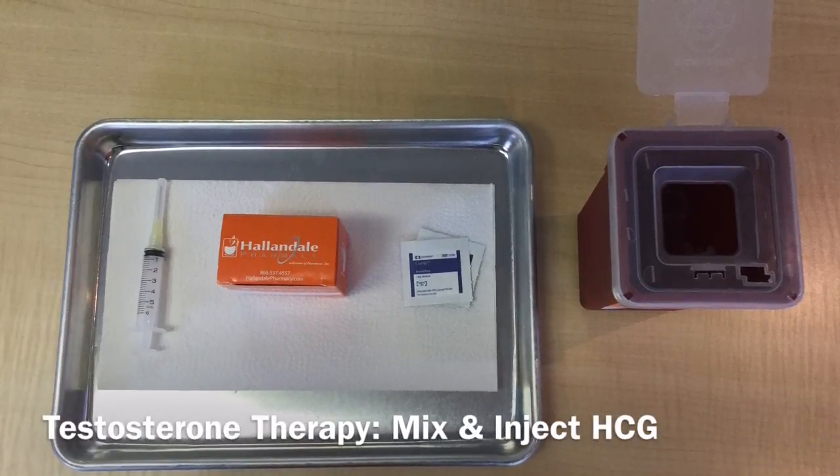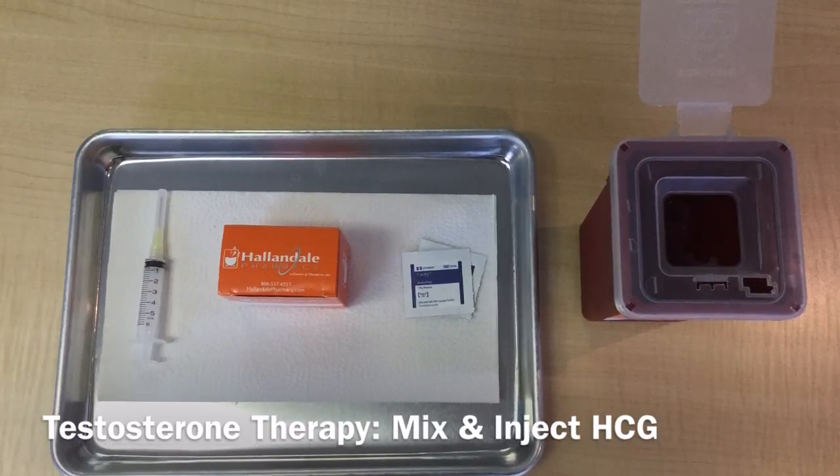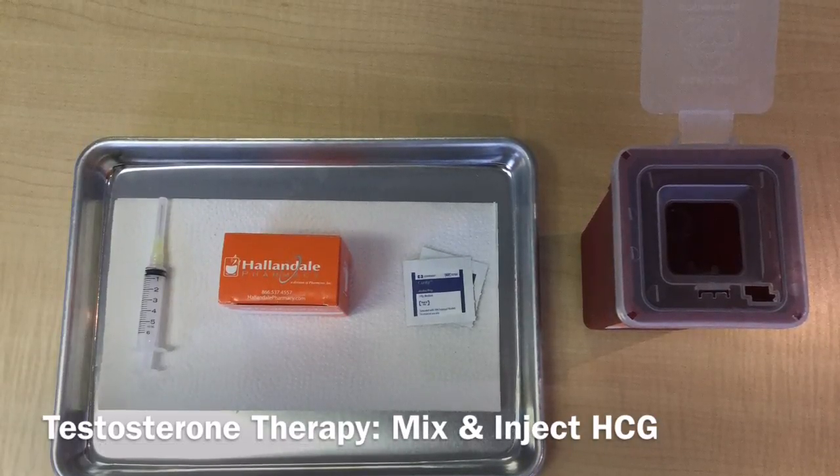Hi, this is Dr. Katie Disharoon with Low-T99, and today I will be describing how to mix up and inject your HCG solution.